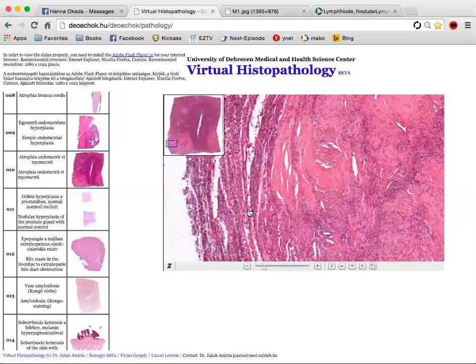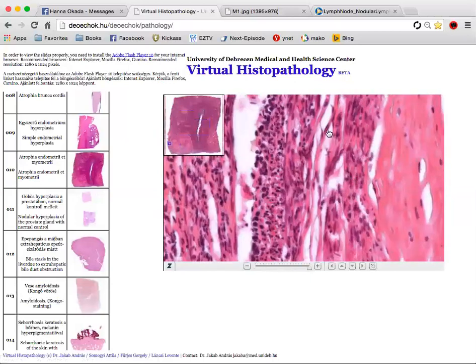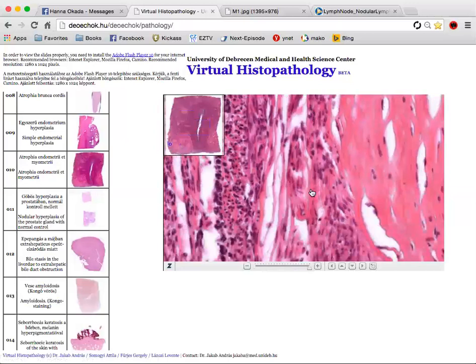I'm going to show you here. It causes what's called compressional atrophy. It presses on the tissue, and it just atrophies. Like if you think of a person that broke their arm and they put a cast on and they take it off after like 6 weeks, and the arm looks a little thinner than the other arm. Yeah, exactly. It's the same thing.